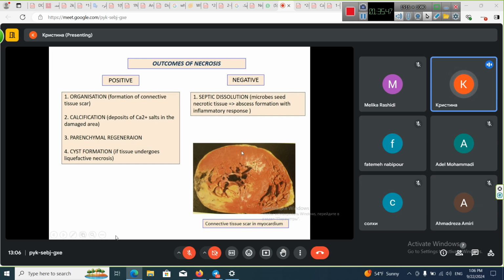more red in color. This is normal myocardium, red because here we have cardiac muscle cells. Here the more yellow color is for adipose tissue in epicardium. It is normal tissue. Here everything is okay, but we should look at this area here.